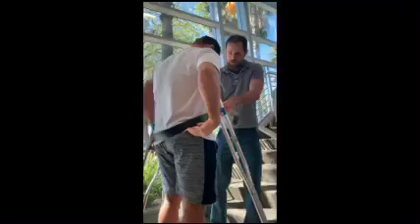Now let me have a patient. I'm going to be holding the gait belt from behind you going up the stairs. You are going to step first. I will step after you, and then you will step again. If I have to cue you to stop during, we will. But in general, that's how we'll be stepping. This is the worst application of the gait belt ever. And then, how do you feel comfortable holding the crutches on your left side? Do you want to hold them in a T position, or do you want to hold them both?